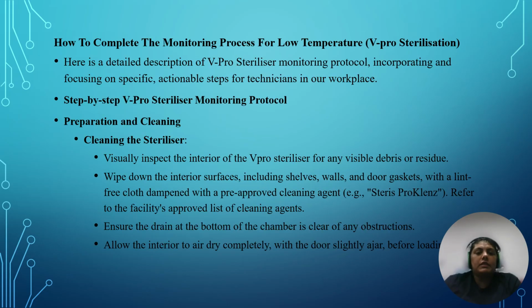How to complete the monitoring process for low temperature VPRO sterilization. Detailed description of the VPRO sterilizer monitoring protocol, incorporating and focusing on specific actionable steps for the technician in our workplace. Step-by-step VPRO sterilizer monitoring protocol. Preparation and cleaning. Cleaning the sterilizer.